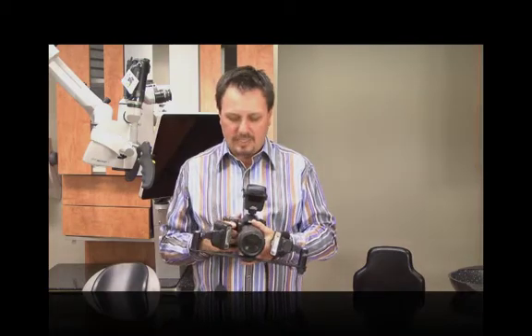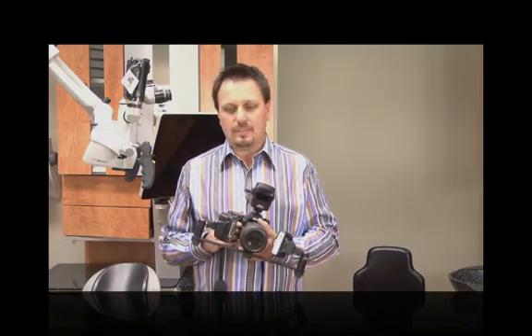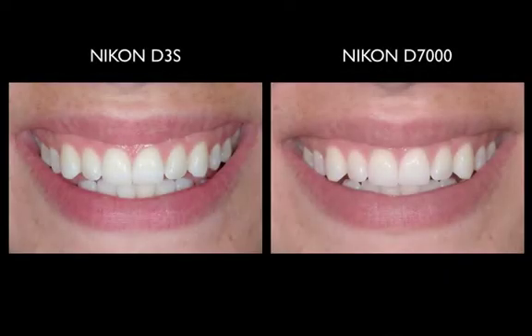I shoot in aperture priority mode with exposure compensation, typically around plus one. Looking at the comparison images, the left was shot with my D3s and the right with the D7000 — both are quite clinically acceptable. If you don't want a really bulky camera and don't want to spend five to six thousand dollars on a camera body, the D7000 is an excellent alternative to the D3, D3s, or whatever the next pro-level Nikon comes out with.